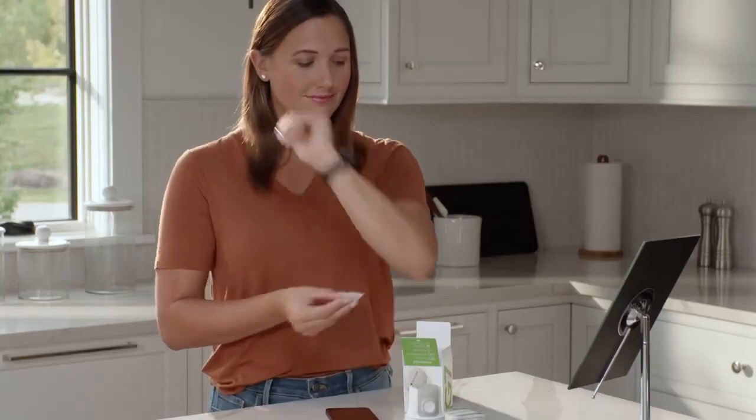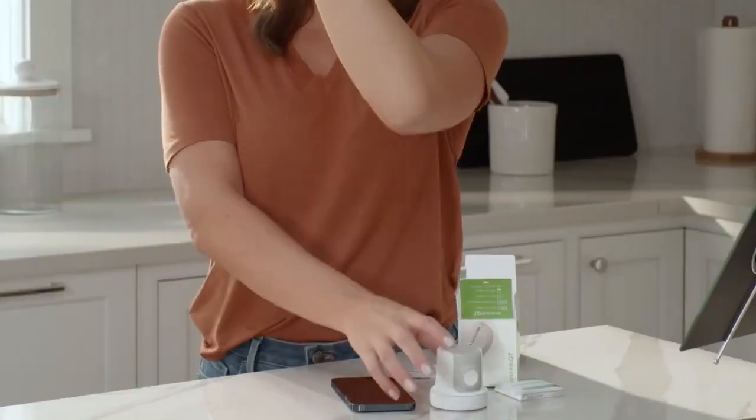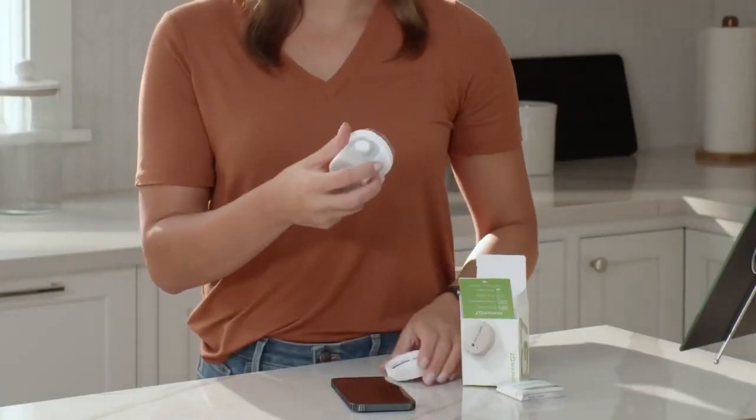Clean your site with an alcohol wipe and let it dry for at least 10 seconds. Grab your applicator and unscrew the cap. Don't touch inside the applicator.